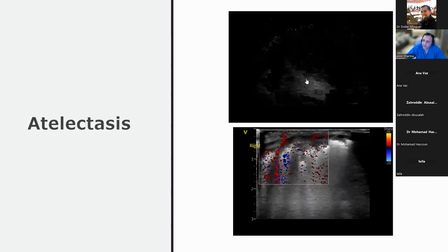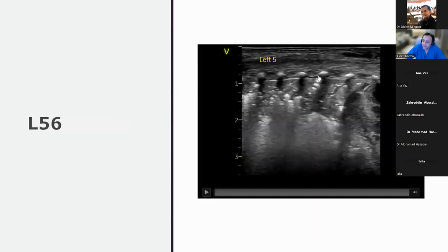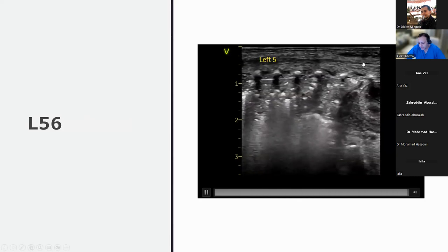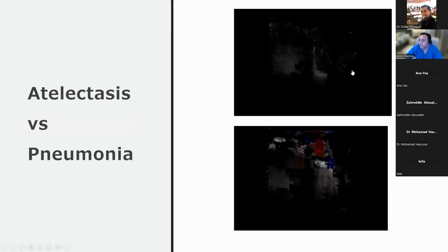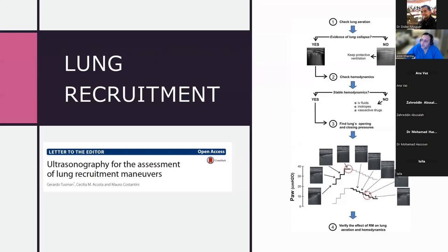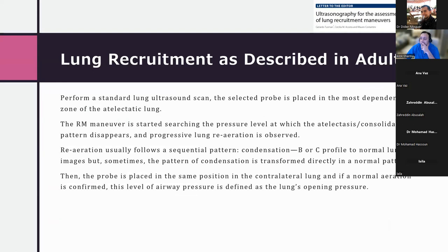And for me, if I look at L5 and L6 at this particular point, they're really bad. So I am going to start with the L6 region, because you can see spleen with diaphragm there. From my perspective, I'm going to put my probe dependently in this position, and I'm going to go up in increments of PEEP by one. I don't do twos. I do ones in these situations. Now, what's classically described in the literature is that you do it every 1 or 2 minutes. And once you're doing it, you keep your probe and look for re-aeration of the lung.